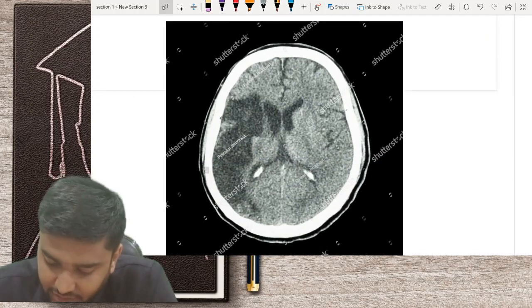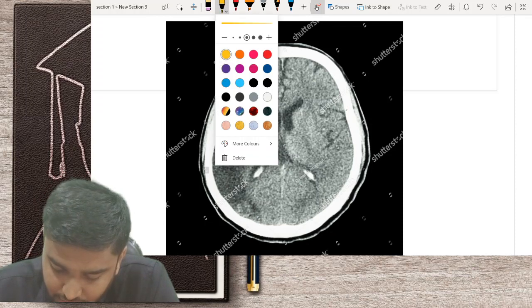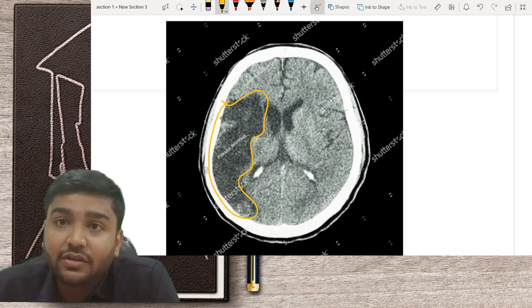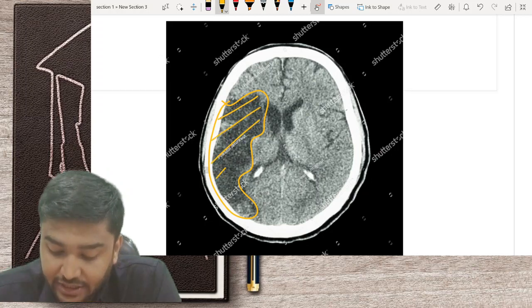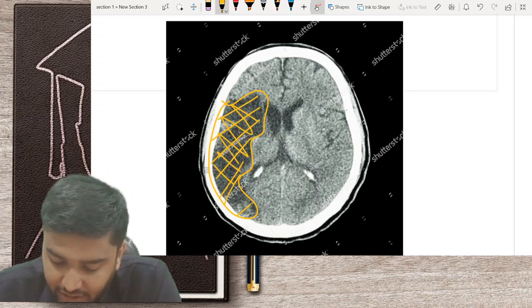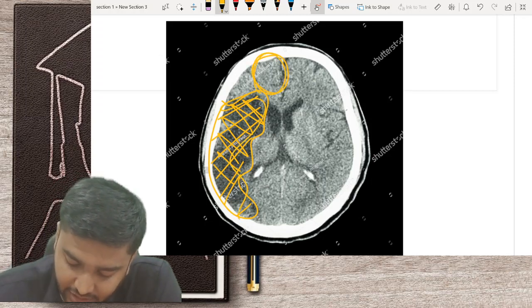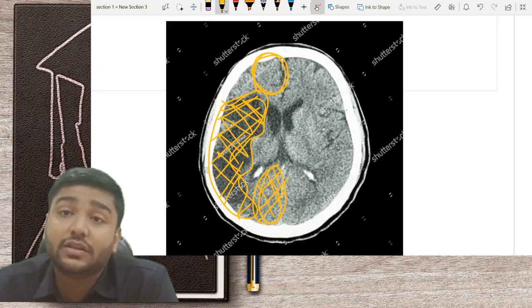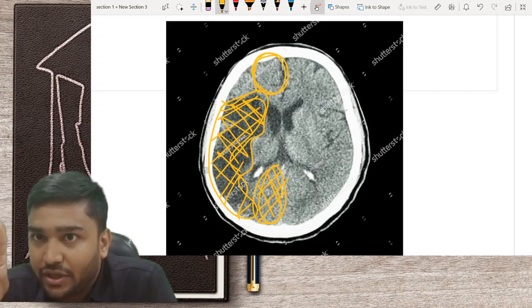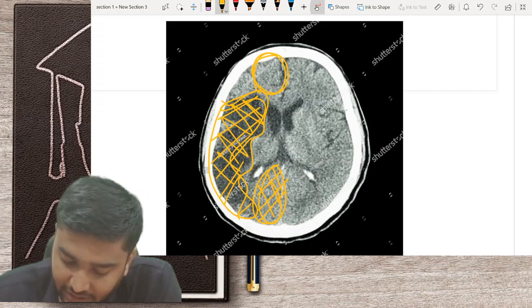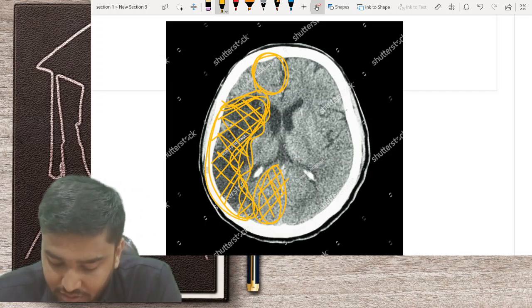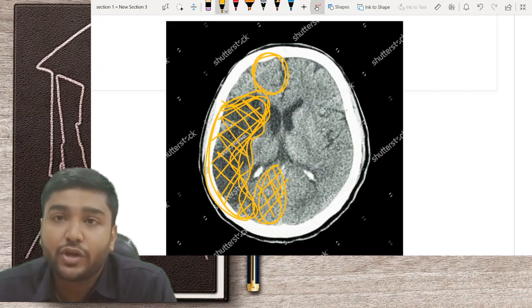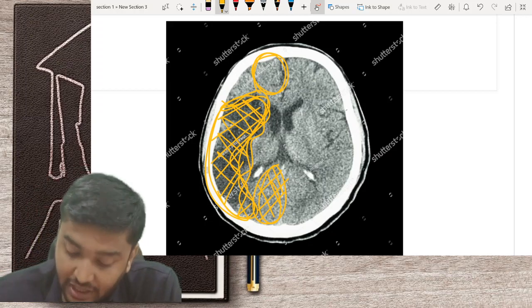As discussed earlier, anything which looks black on CT is either infarct or edema. Here you can see an MCA territory infarct. The ACA territory is here, MCA territory is here, and PCA territory is here. Infarct is always territorial — the blackening will be seen in a particular vascular territory. Because this is very black, it is a chronic infarct that occurred at least three or four months ago. The best modality to detect infarct is MRI, not CT, especially in emergency circumstances.